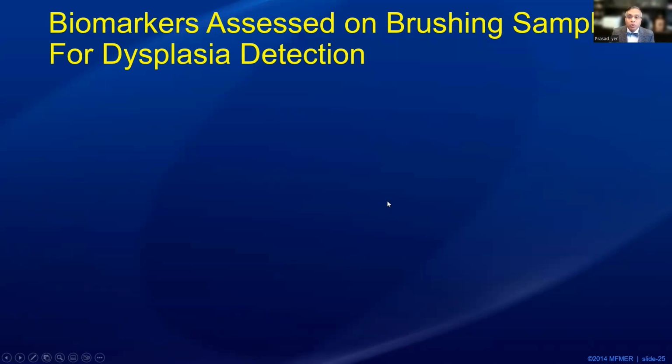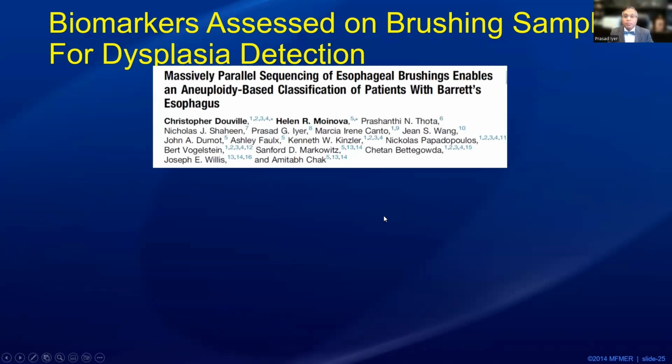Now, the next component I want to talk to are the possibility of combining brushing samples, and these are brushes that are obtained using conventional cytology brushes with biomarkers.